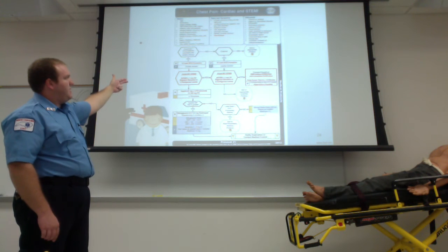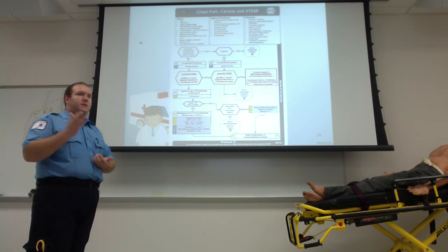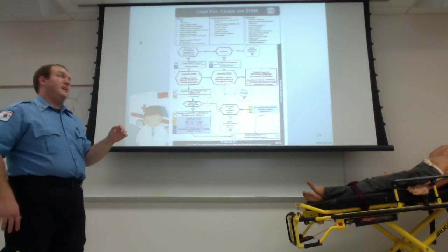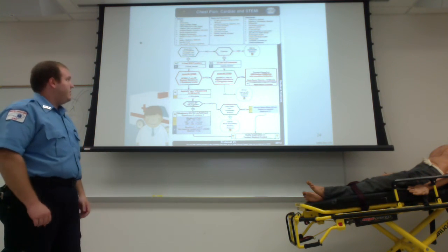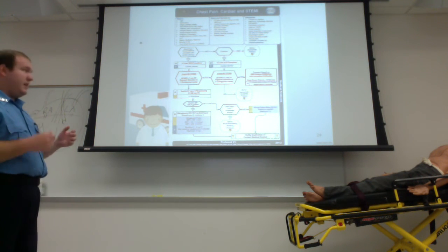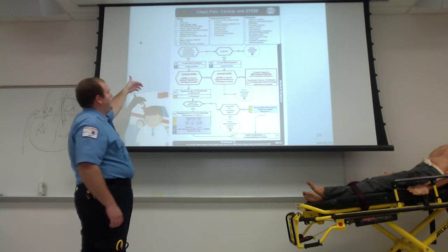The reason why the P is on cardiac monitor, basically it's just saying that the basic cannot confirm and can't monitor that rhythm for a running period of time. The paramedic has to be the one to do that because they've had the extra 6 months of training just on cardiac issues and what's going on there. Follow your algorithm down some more.